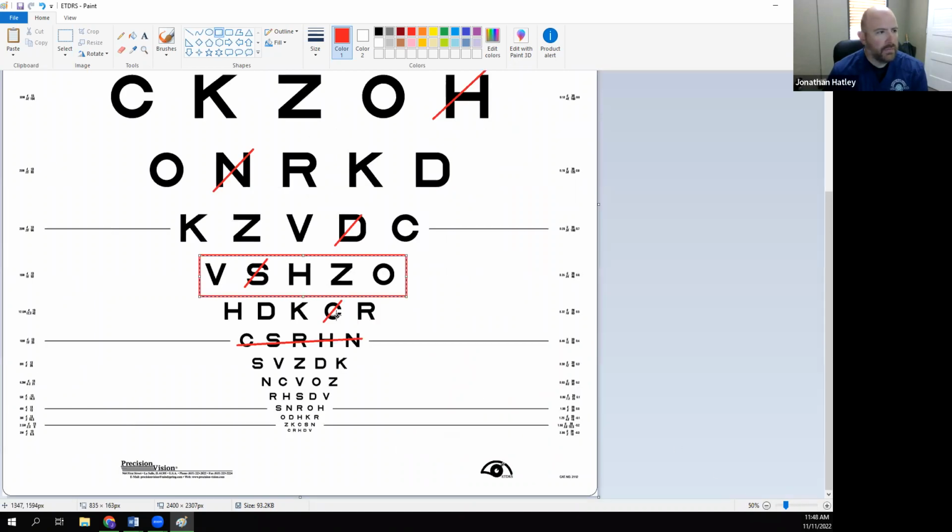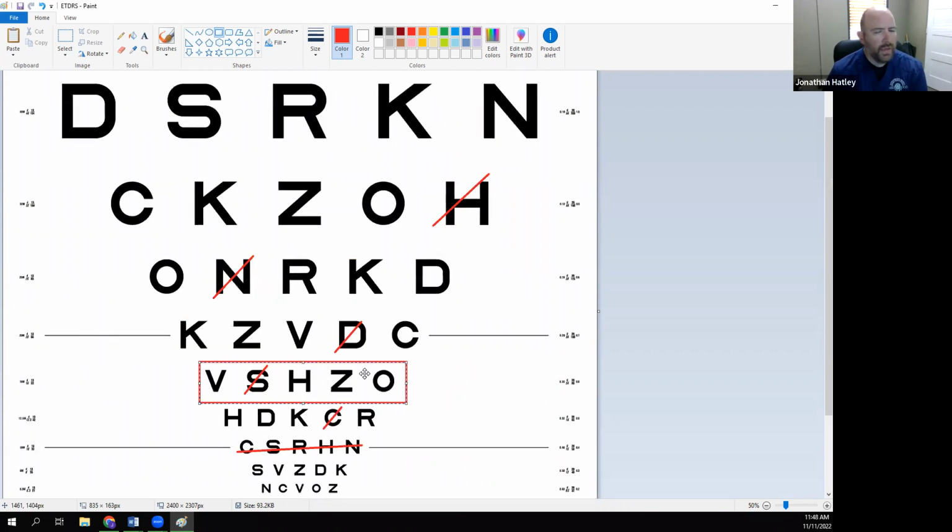Speaking of M notation, it is important for the students to utilize this M acuity. In the residency guide, I did say that it was okay if they use Snellen. Some students will want to calculate the exact visual acuity. If you have any students that do that, it would be important for you as the proctor to write down the number of letters that the patient got correct, and the test distance, and then speak with either myself or Dr. Ma, and we can give you the exact visual acuity, and then you can compare it to what the students wrote down, and see if that's correct.